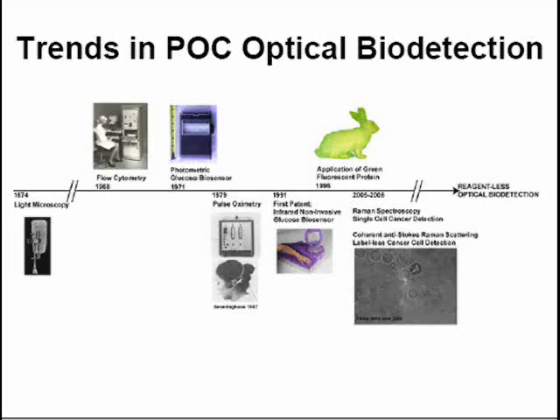In 1991, we have the first patent filed for infrared non-invasive glucose monitoring. Not much has been done in this field, although it's still moving forward. We have not heard much since this patent. There's been a few devices that show up here and there, but mainly prototypes rather than any devices that have been used in the clinical setting.